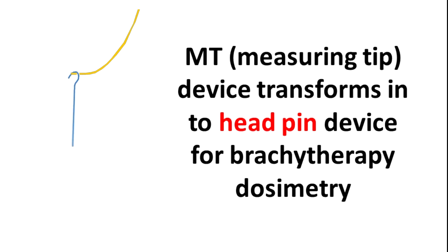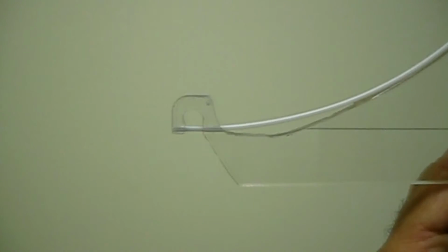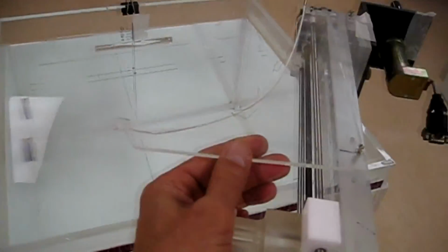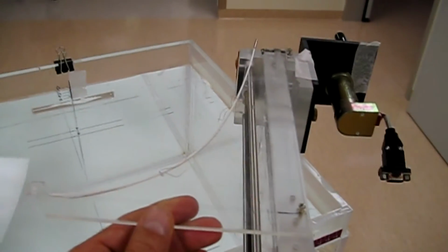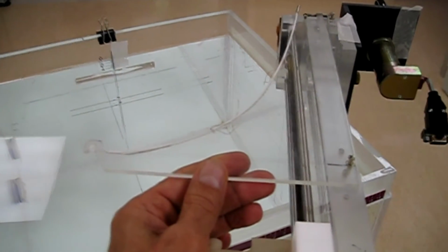This is the so-called headpin device. For this design version, we use the same source holder as described in the last presentations. It is a so-named curved catheter layout, where the radiation source is pressed to the lower wall of the catheter when it is moving to its dwell position. Non-parallelity of the ionization chamber and catheter we see from the shape of the electrometer current when the source is stepping along the catheter with a 3 mm step. To correct parallelness, the holder has angular adjustment.